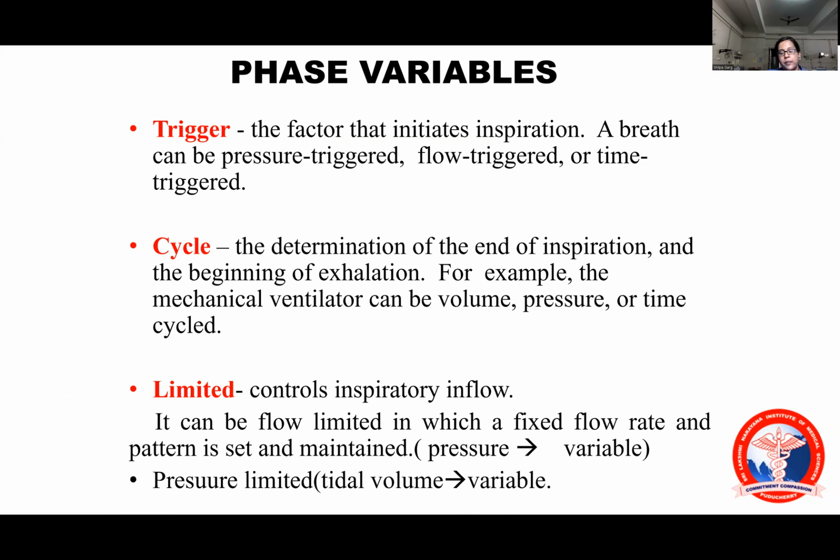So which is going to initiate? That is the trigger. Cycle is going to determine the end of inspiration. So trigger is going to initiate and cycle is going to end, and it causes the beginning of exhalation.